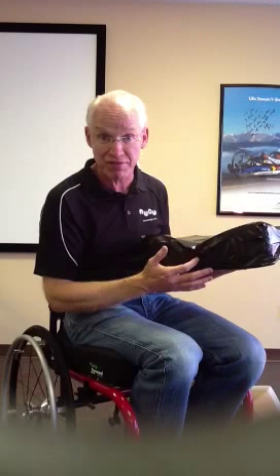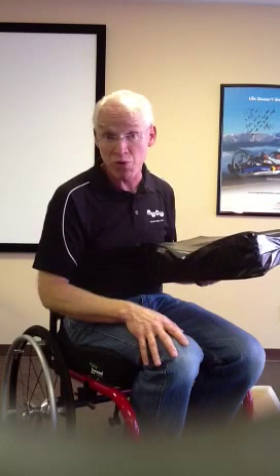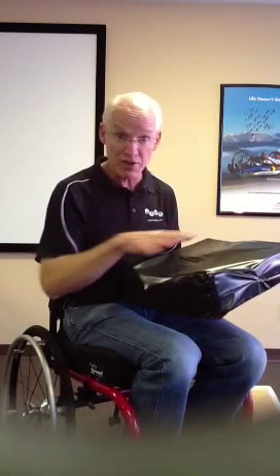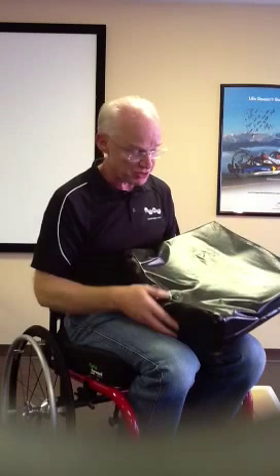And you will see that there are no seams or zippers in the path of that flow that would wick that moisture into the cushion, thereby deteriorating the cushion. So we're protecting the cushion through the covers and the contours. Now, with respect to the client, if I were to try to convince you that this would be the cushion to sit on with just the incontinent cover, you would agree that that would be one hot, sticky cushion. So we need to keep the person up off of this cushion.